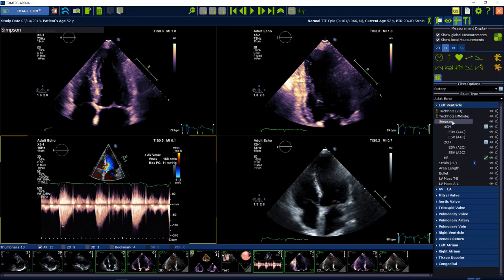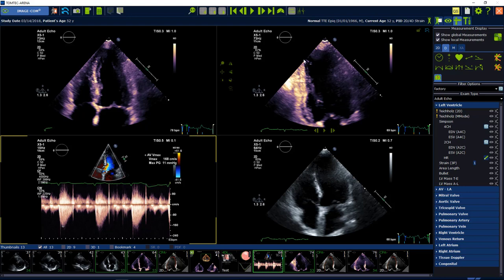Here you see already the automatic detection button, but before we start the analysis we have to check our images. They should be in the right orientation, so the standard orientation. If they are not in the standard orientation, please use the flip and rotate buttons in the smart regions to adjust the image orientation.